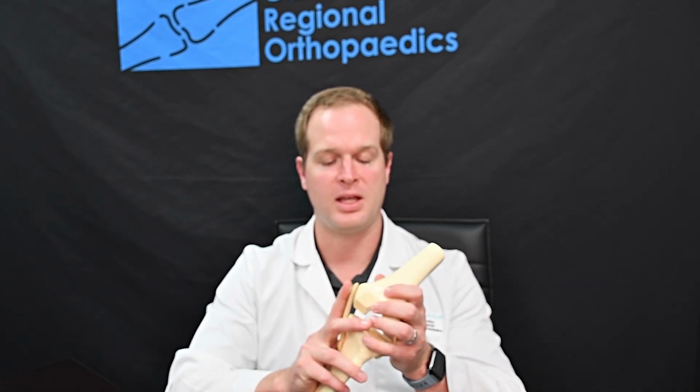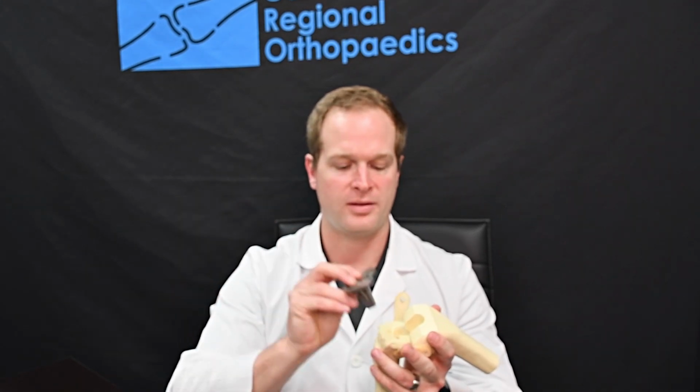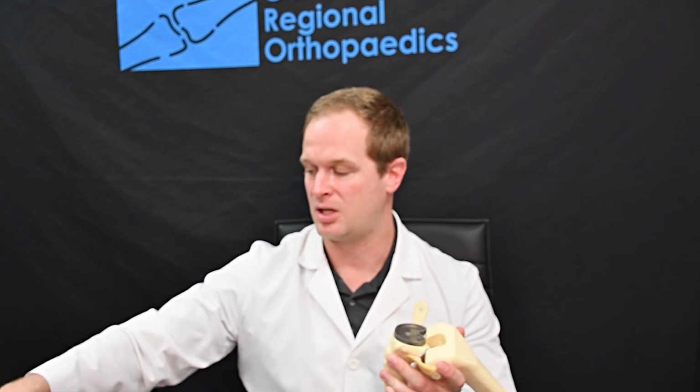After the bones of the knee have nice, smooth surfaces, we then go through with some specialty parts and pieces and we put them into place. A piece of cobalt chrome will go down inside of the tibia, and that is this piece here. It is again made in New Jersey.